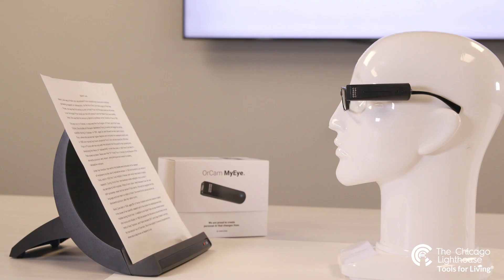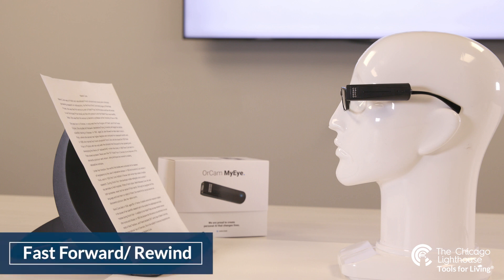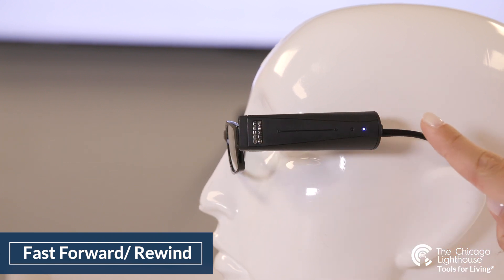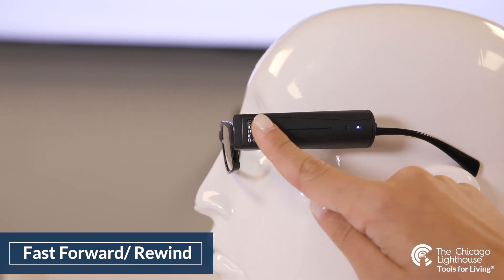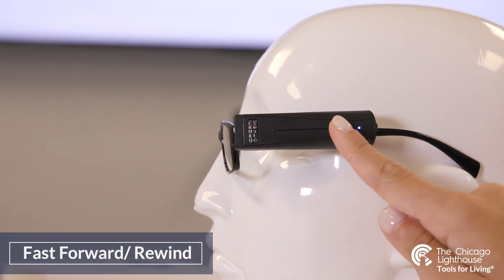Once the OrCam begins reading to you, you no longer have to look at or hold your text and can place it down. While it's reading, swiping your finger along the side of the device will fast forward through your text rather than raising the volume, or rewind in your text rather than lowering the volume.